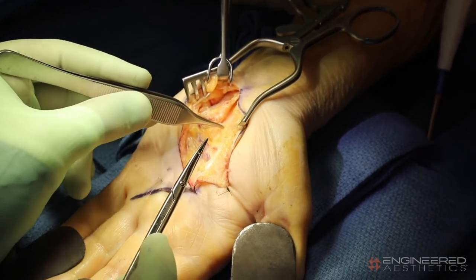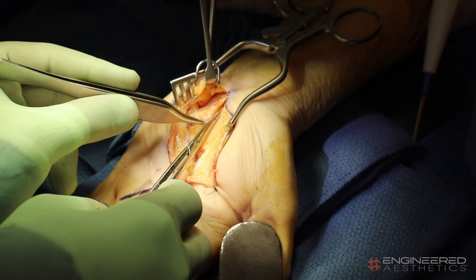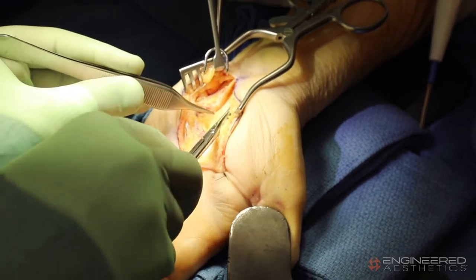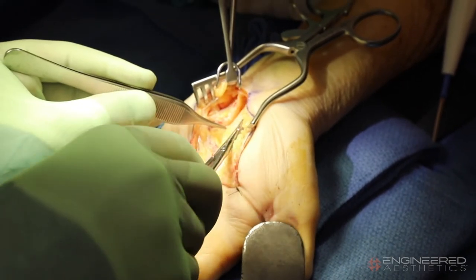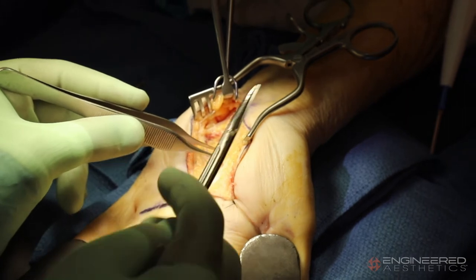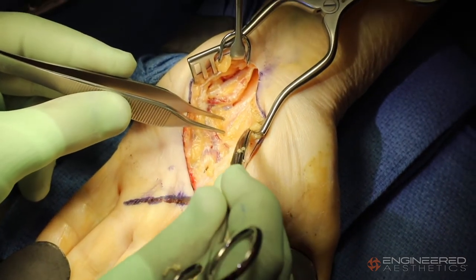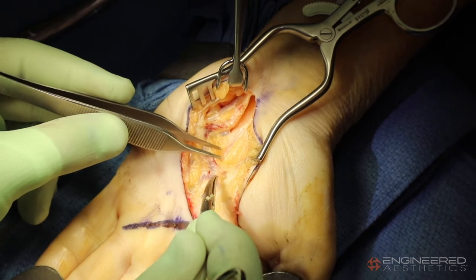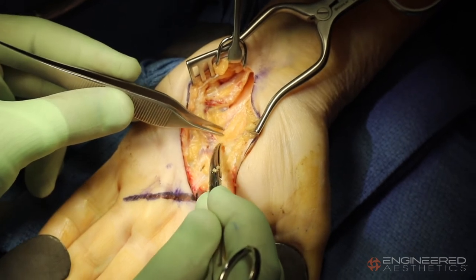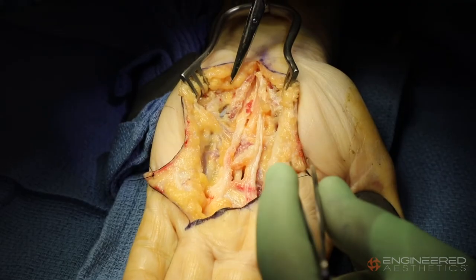Now I'll direct my attention to the median nerve, which I will gradually dissect free from a lot of that scar tissue, and then ultimately apply a nerve wrap around the nerve to prevent it from getting scarred in again. It's very important to be very careful around these nerves — they are temperamental organs. Here's another fantastic piece of anatomy as the nerve emerges from the carpal tunnel. This is the extent of the carpal tunnel. It starts to branch, giving branches to the thumb, the index, the middle, and half of the ring finger. There are three individual common digital nerves that will ultimately split distally in the palm of the hand.